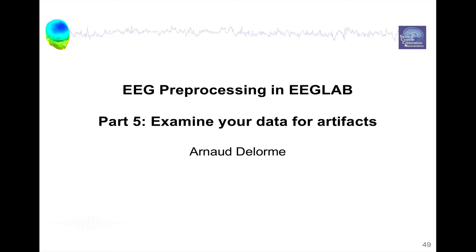Hello, my name is Arnold Delorme and I'm the main software architect of the EEGLAB software. This is part 5 about EEG preprocessing in EEGLAB, and this part is about examining your data and looking at artifacts.